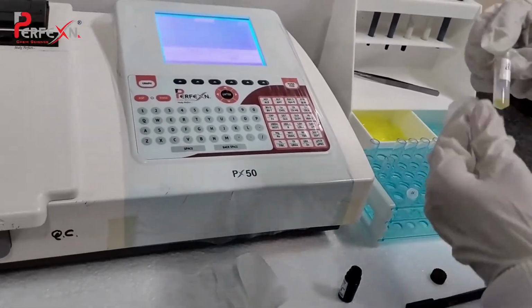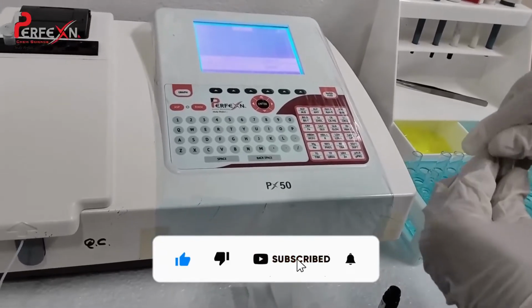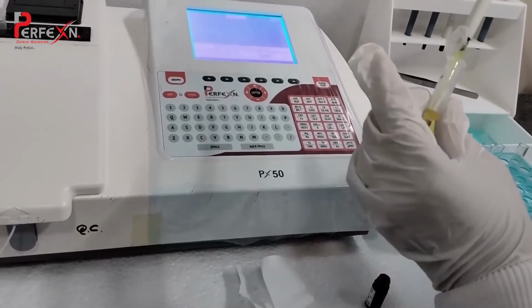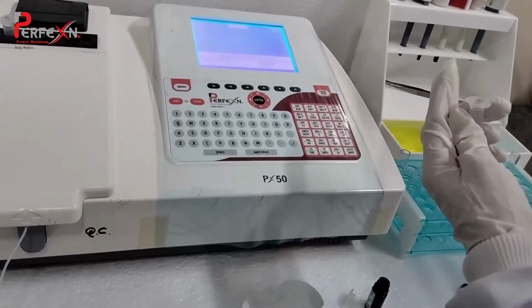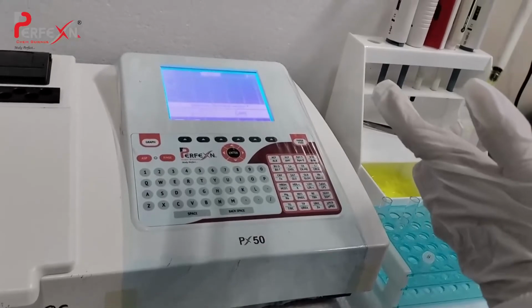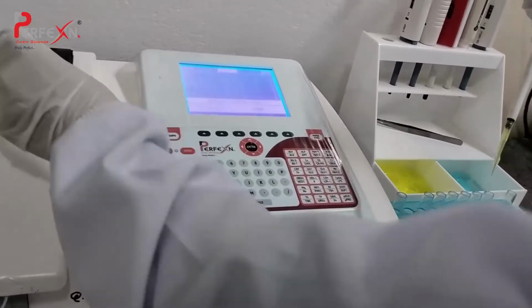Here I have taken the Biochemistry control level 1. This is being used as a test. Here I am taking 10 microliter in the sample test. Wipe the excess of the sample, mix it in the test vial, mix it well and incubate it for 5 minutes at 37 degrees Celsius.